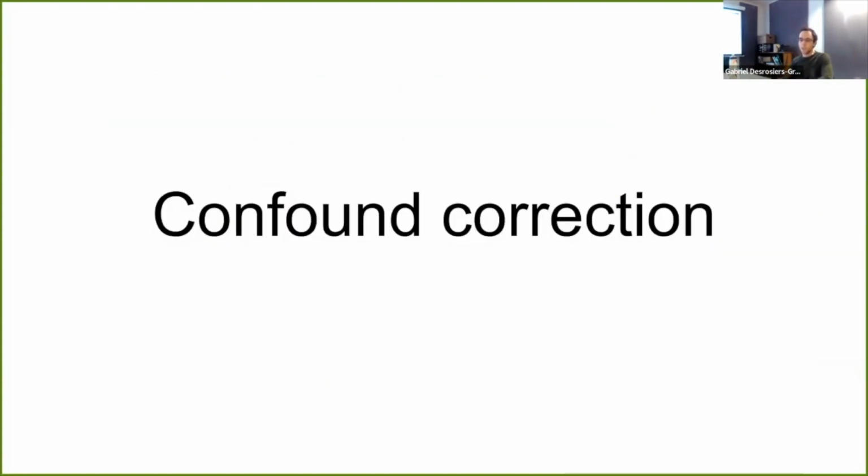So that's it for pre-processing. Is there any question that could be addressed at this point? I don't see the chat. I've been taking care of the chat. Any verbal questions anybody wants to bring up? Okay. We'll say going once, going twice, sold. Continue on. All right. Then let's move on to confound correction.